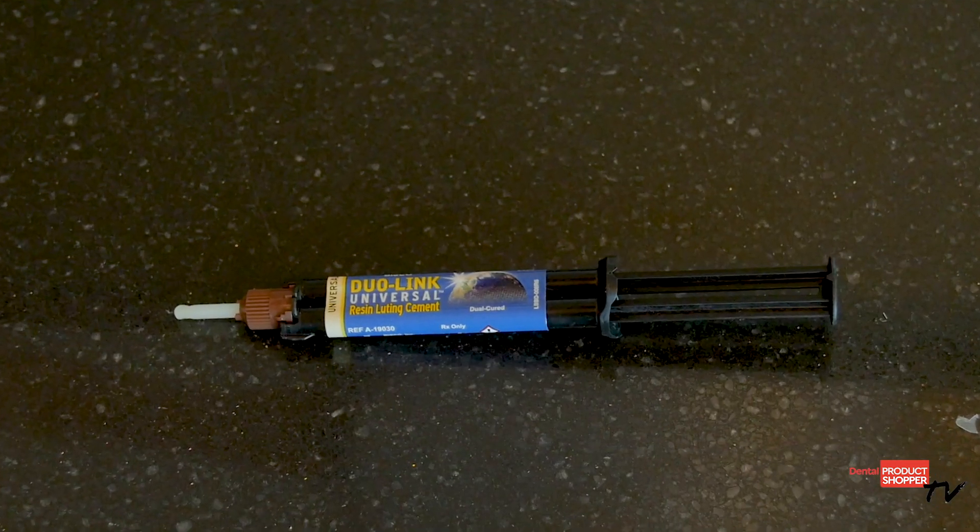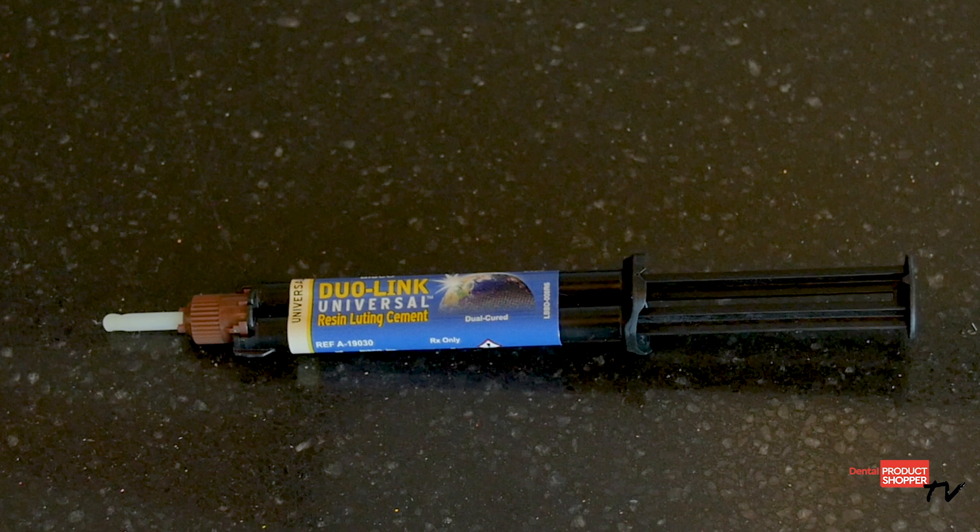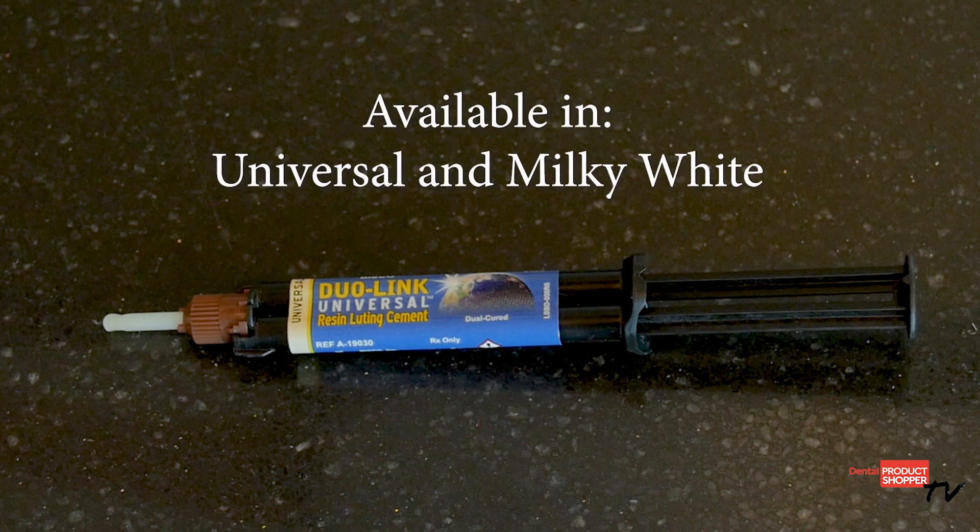Dual Link Universal comes in a dual syringe providing a consistent mix for immediate delivery. It is available in universal and milky white shades.